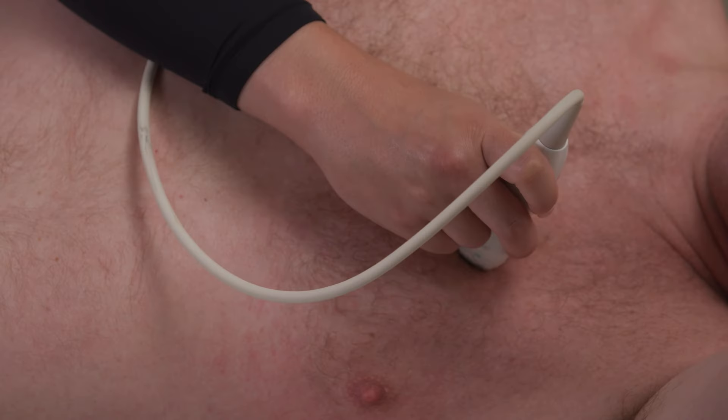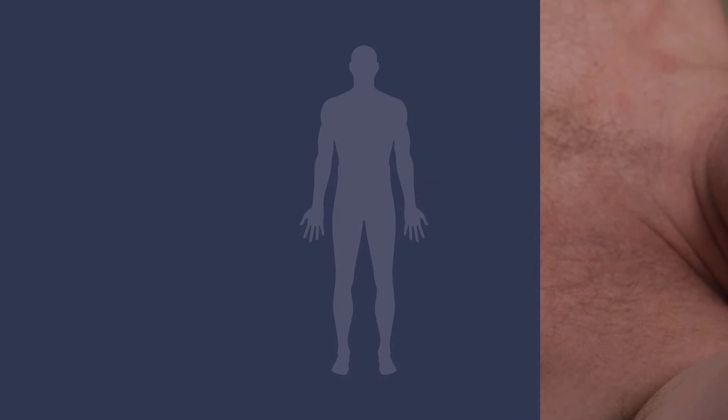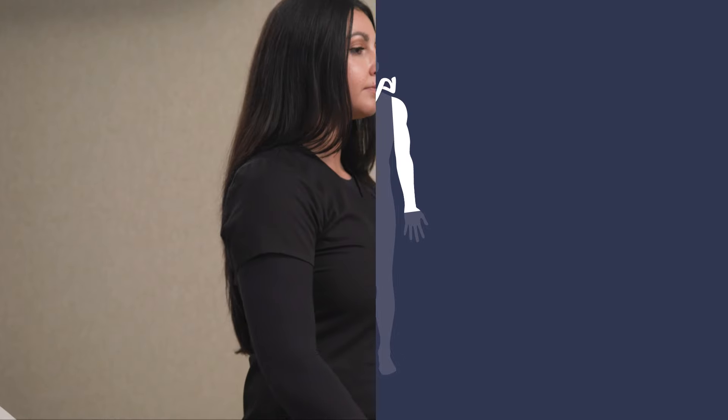In this video, we will go over simple ergonomic adjustments and probe handling techniques to minimize the risk of pain while scanning. Capturing ultrasound after ultrasound can cause a lot of strain on your wrist, arms, neck, and back if you are not correctly positioning yourself and the ultrasound system.